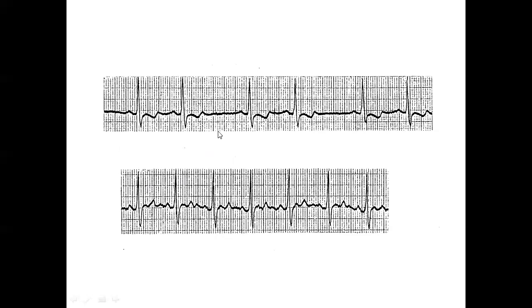And that's why you are able to line up this with this one and so on. So there's no blocked P, but unusual for QRS to be paired like that. Should we say atrial bigeminy? No, P waves are identical looking, yet there's no P block. So this is a typical SA Wenckebach phenomenon. And of course, you won't be able to put two of these in here, and you have to meet that criteria.